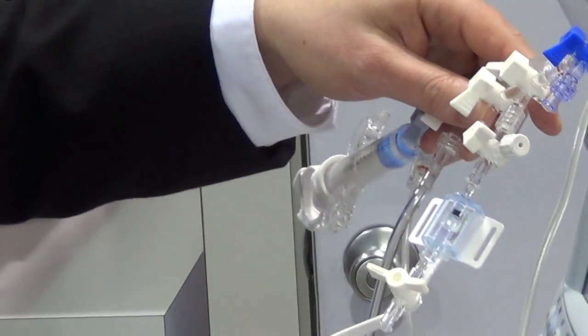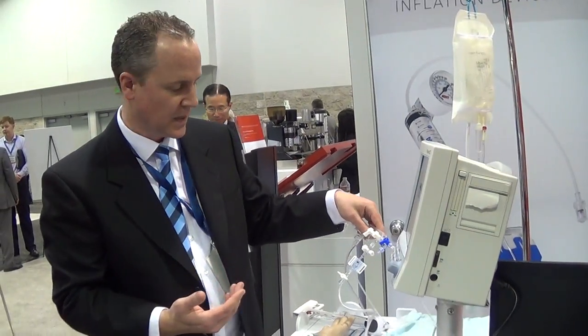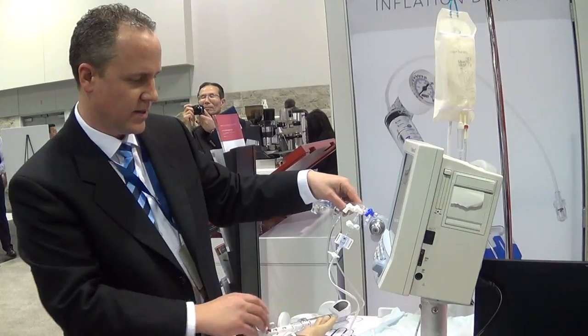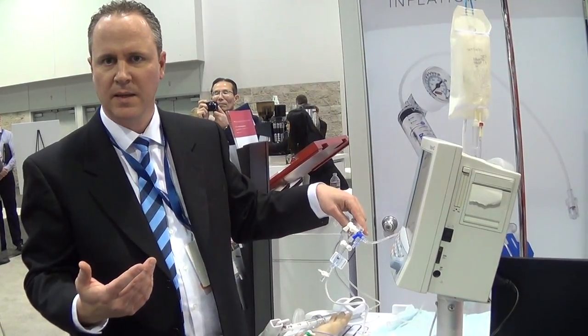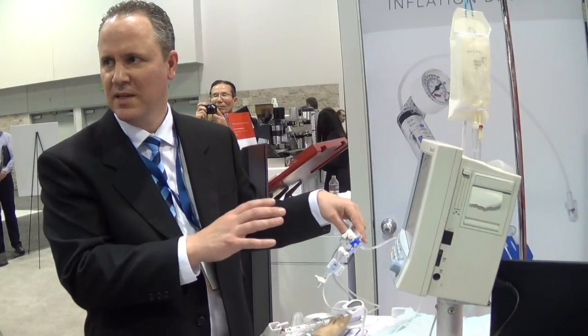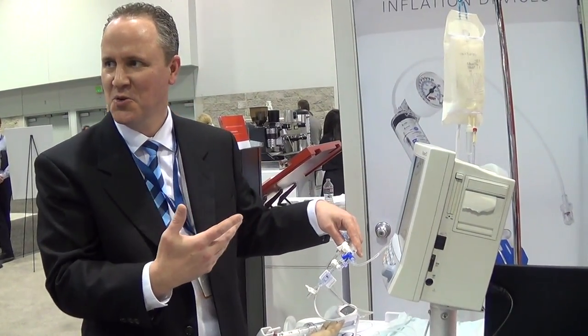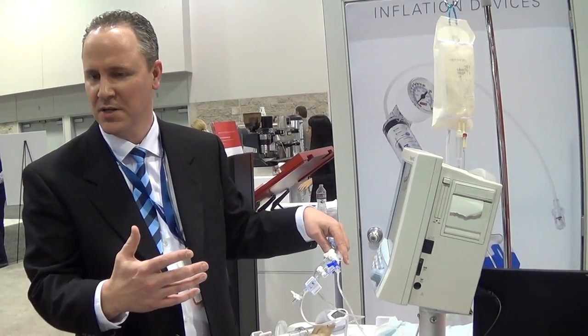The electrical cable is connected to the blood pressure monitor, and this is the same monitor you would see in any hospital. In this particular setup, this is something very similar to what you might find in a cath lab. This setup took me maybe an hour to set up on my own, but it's something a nurse can do very quickly — maybe within a minute they have this all set up and ready to go for the operation.